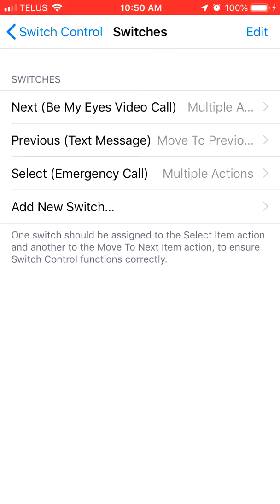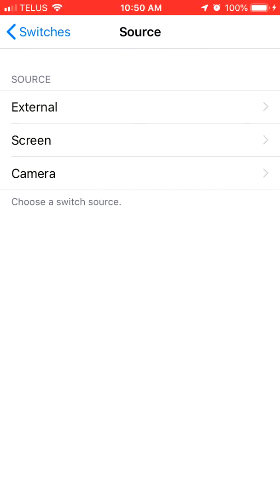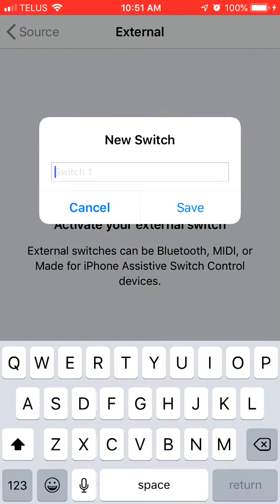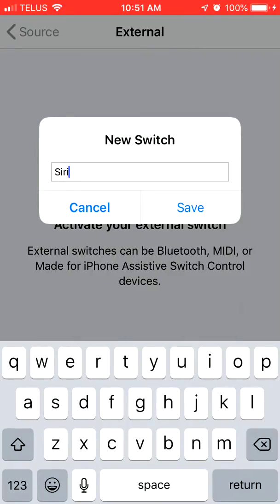We're going to go back, and we're going to add a new switch. External again. And in this case, we're going to press the switch located in the lower left corner of the button interface. And we're going to label this switch as Siri, as its primary function will be to activate Siri on your phone. Its alternative function will be, one of the alternative functions will be to access the Google Maps app in order to get navigation directions. So we're going to put Google Maps as the alternative function.